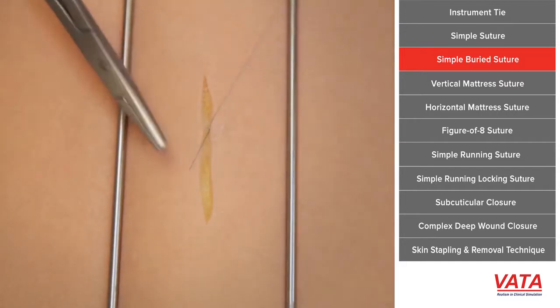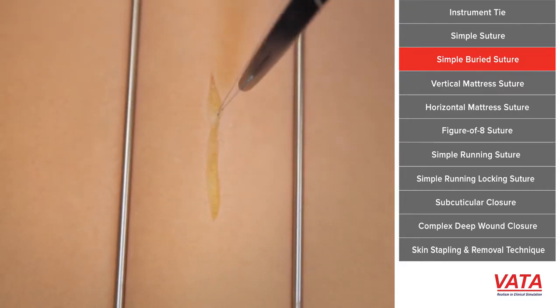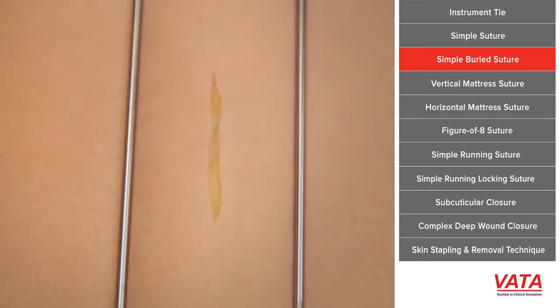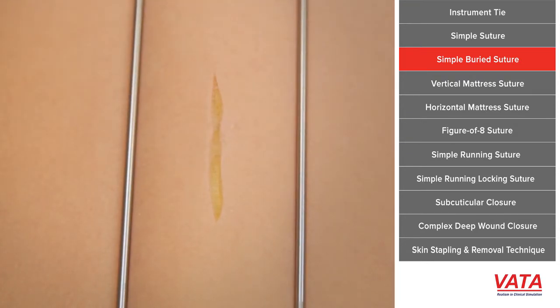Notice also when I'm pulling, oftentimes I'll pull it along the wound. It allows you to get the tie all the way into the wound, and it's not being prevented by the skin edges. So this is a simple buried suture — something that we use all the time in plastic surgery.